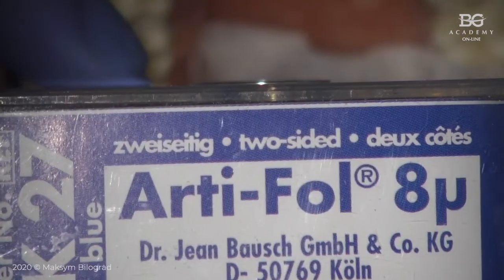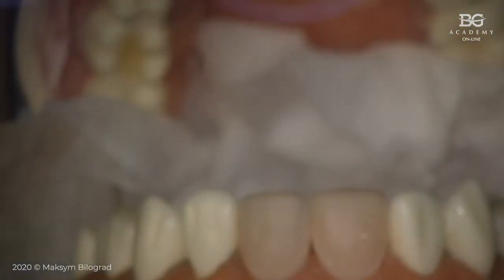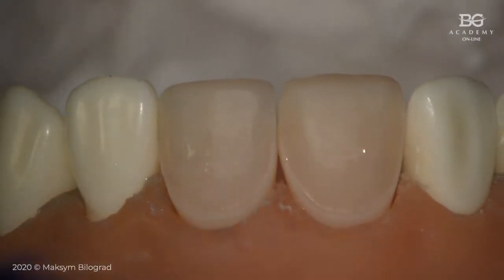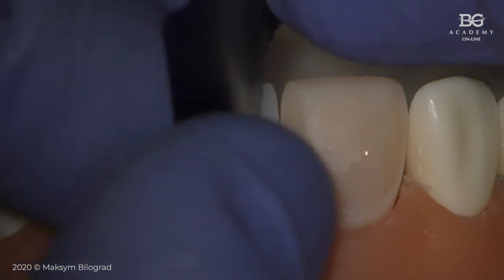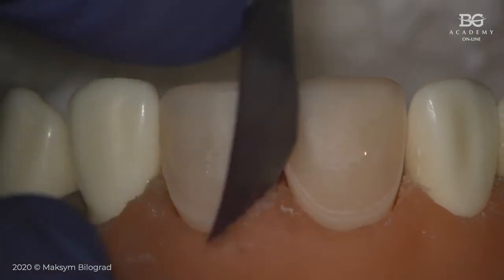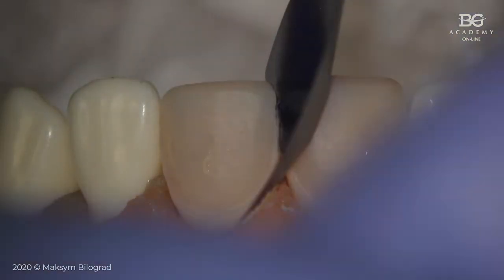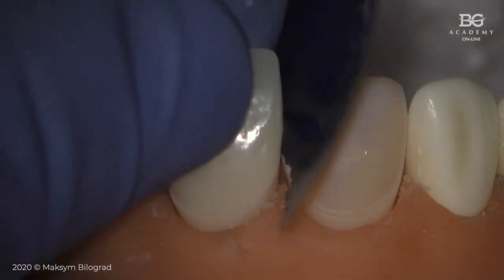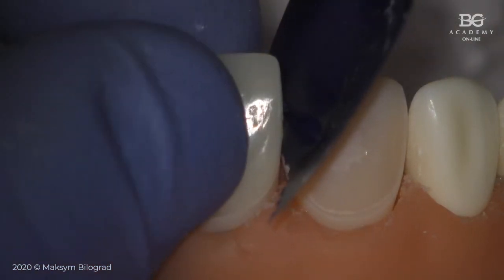Artifoil, 8 microns, okay? We can put this Artifoil between the teeth where we would like to check our interproximal contacts. It is not always needed in every single case, but sometimes you may have a tight interproximal contact problem. So we put veneer 1, we put the second veneer.